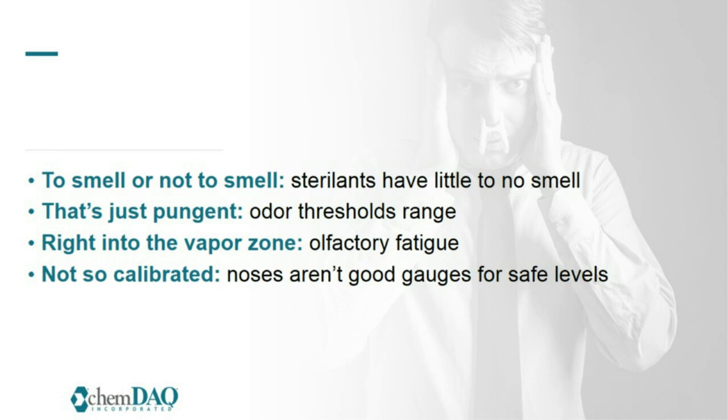Come on now. We know how crazy it is in sterile processing, so coupling this busyness and hecticness that goes on in our department with allergies and running around, our noses are going to get tired and we're just going to get used to these smells. So, not so calibrated. Noses aren't good gauges for safe levels. The bottom line is that our noses have not been calibrated to determine whether a liquid chemical sterilant is below or above the parts per million threshold for safe practice.